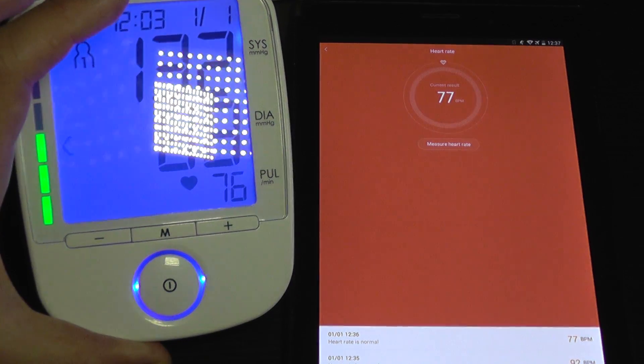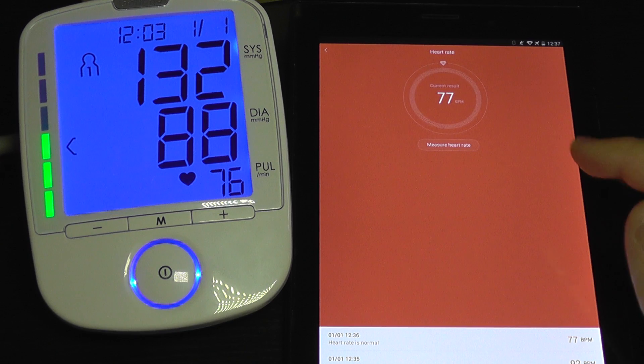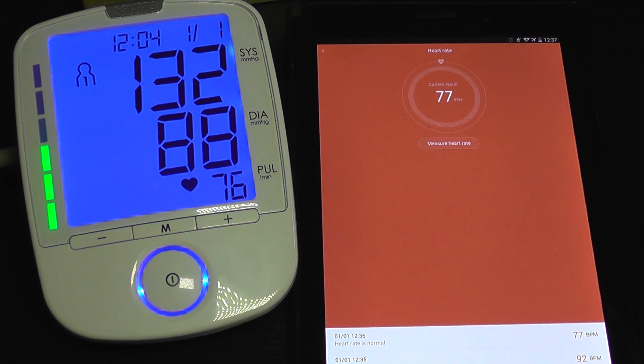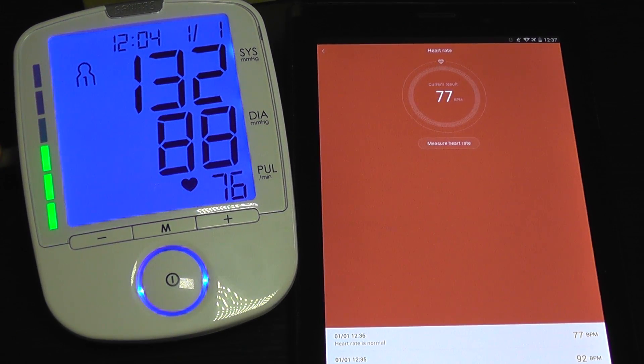And it's 76, so it's very accurate. You can see that compared with the medical device, the results are almost identical. So the heart rate sensor seems to be very accurate. Bye bye.